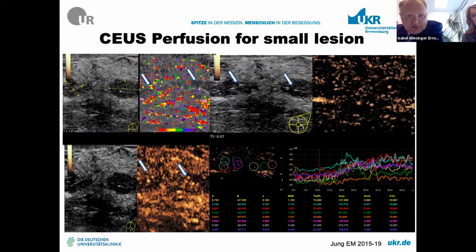If you use high resolution contrast enhanced ultrasound, you could find a decision: could we see an early and irregular hyperenhancement or not? Could we find an early washout or not? And you could also find a decision about the dynamic microvascularization using time intensity curve analysis. It is often integrated in your high resolution ultrasound machine.